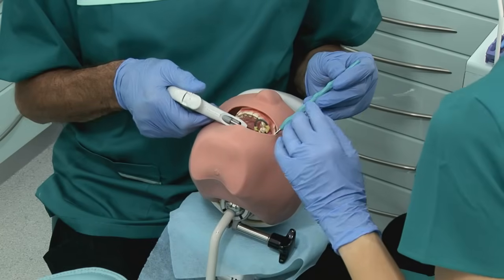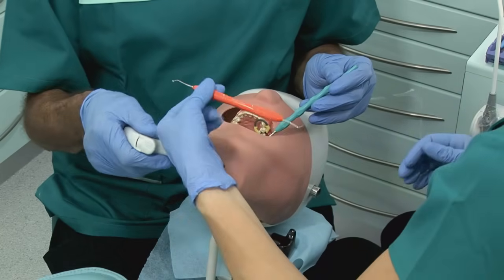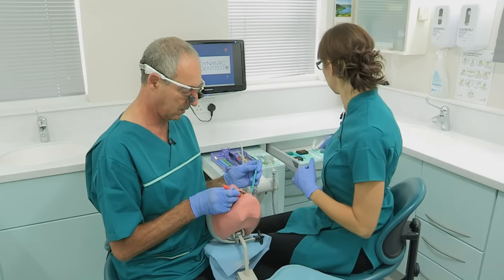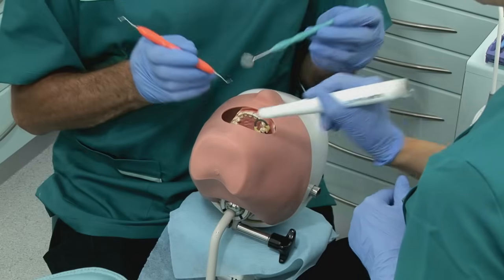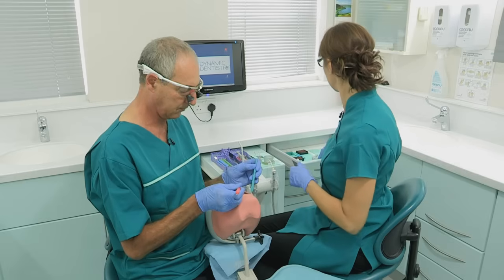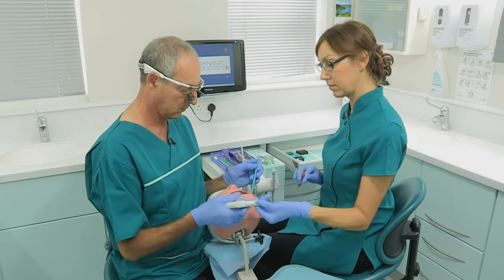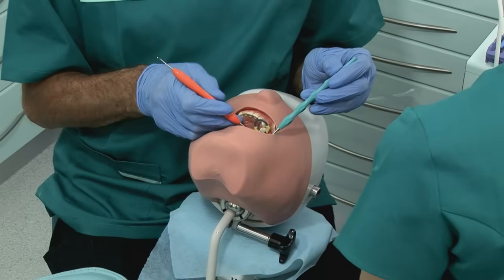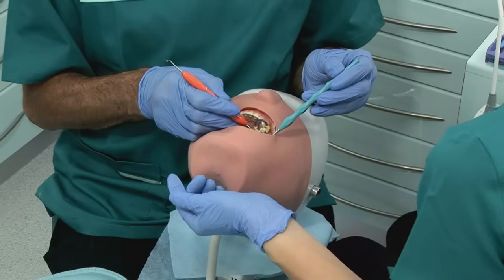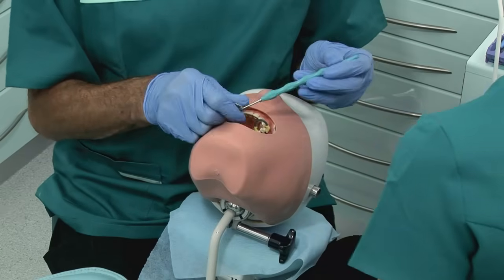We might use a gun, put a little bit in, pack it a little bit, and then we'll light cure. Same thing, might put a little bit more in there. Now, if you choose to do it, putting little bits in with a probe, exactly the same technique would apply. It's just coming from the nurse's side.